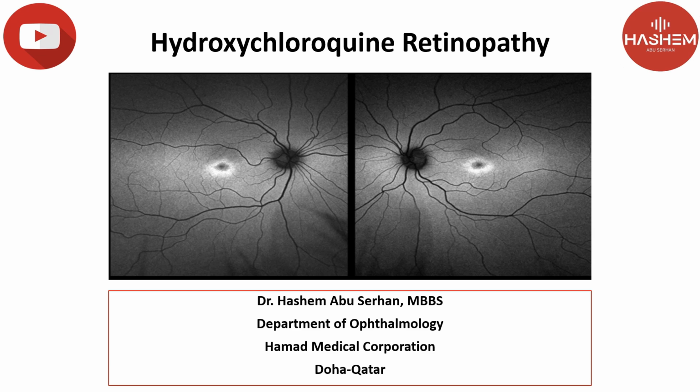Hello everyone, this is Dr. Hashem Abu Serhan. I will talk today about hydroxychloroquine or Plaquenil retinopathy, or what's known as hydroxychloroquine eye toxicity. This is one of the common pictures seen, a fundus autofluorescence image of hydroxychloroquine retinopathy.